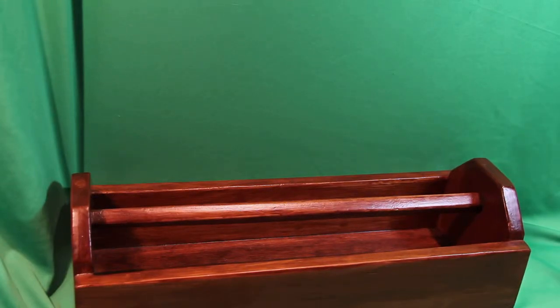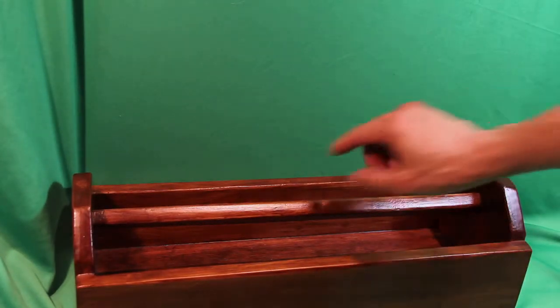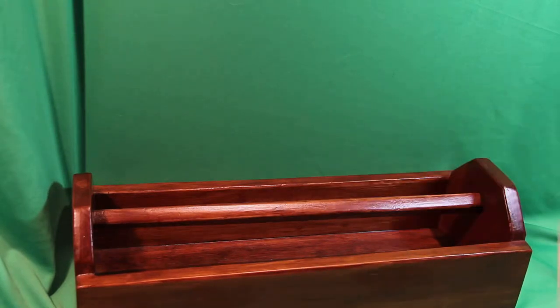In this video, I will demonstrate a square knot using two hands as a right-handed person. We'll use this nice toolbox as an anchor point for the suture. Let's pass the sutures.